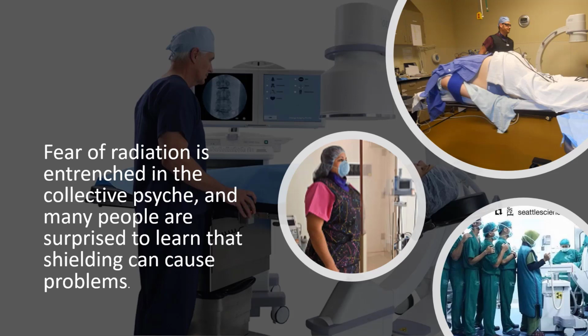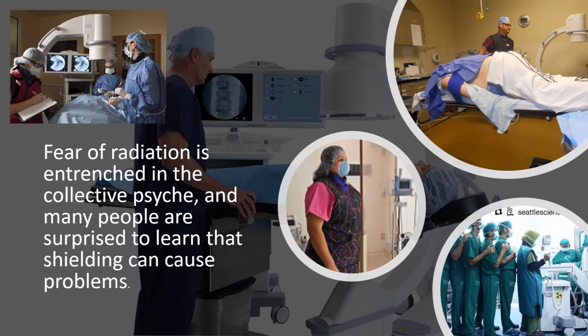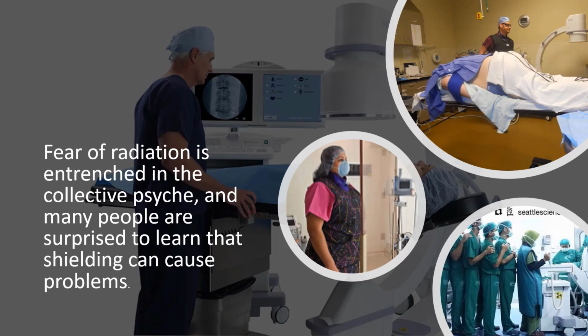The surgeon is wearing surgical gloves that have some radiation protection in them. When the surgeon puts their hand into the direct beam, what happens during fluoroscopy? Well, first of all, you're never supposed to put any part of your body within the direct beam, but say your hand does go into the direct beam, it is going to automatically increase the radiation because there is more to transmit through. I used to say the bigger the fatter, the more the scatter. Anyway, those are simple things that we need to look at just from a radiation perspective and setting the room up correctly and being able to instruct the people how to use their PPE for radiation safety correctly.